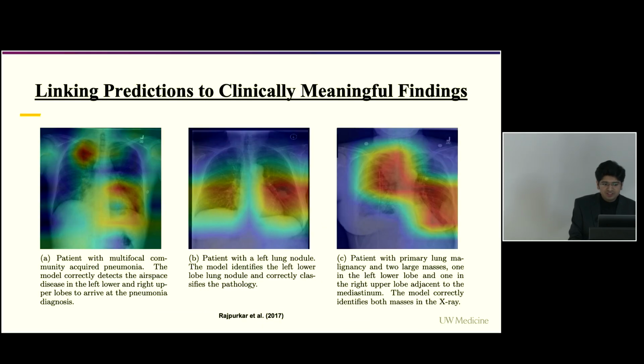Or in the case of chest X-rays, we can go ahead and validate whether the model is picking up on clinically meaningful attributes. Essentially, through these maps, we can see whether it is answering more intricate, more detailed questions well. We can go ahead and dive deeper into the model's predictions and understand what exactly is going on behind its predictions.